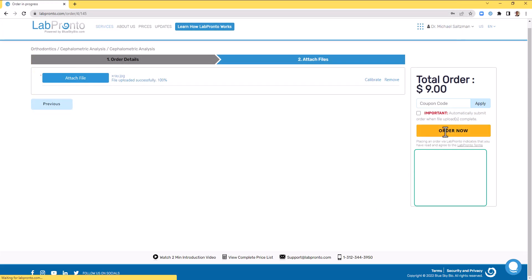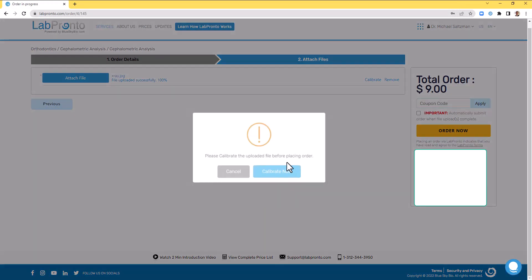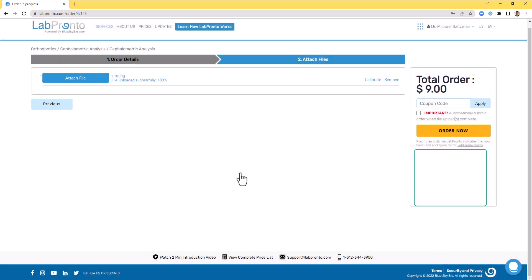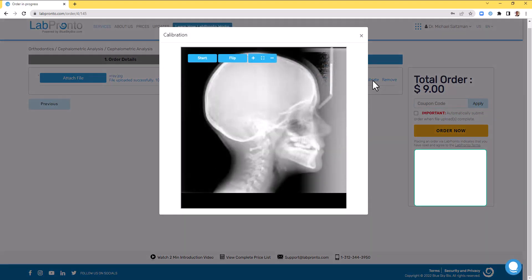Try to place the order by clicking order now. You'll receive a message saying that you're required to calibrate, and you can click calibrate now, or simply before pressing order now, just click to calibrate.